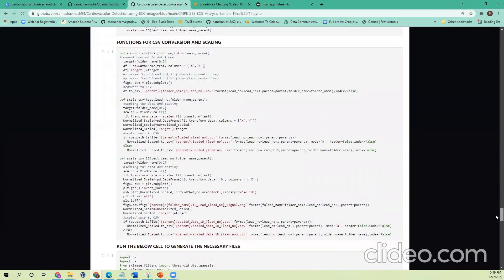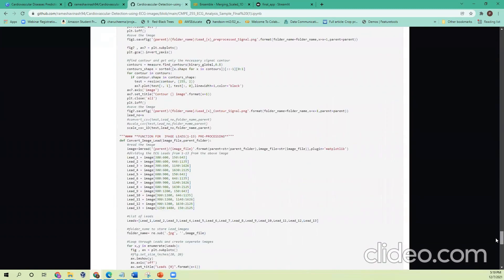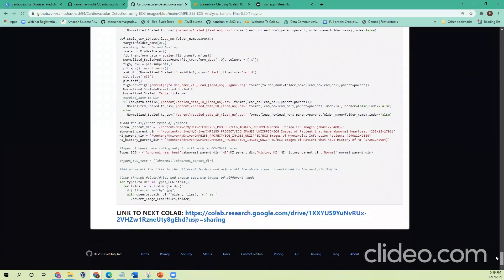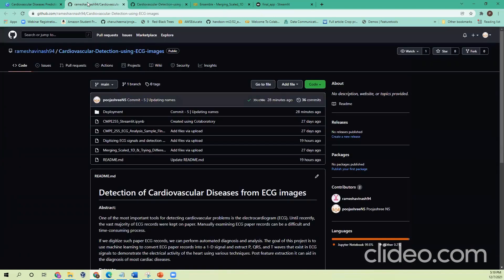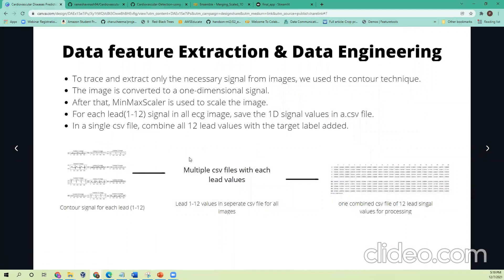Here we have functions for looping through all the files in a Google Drive, extracting all the signals, lead signals, and CSV values. For the feature extraction and data engineering part, once we get the contour image and extract the CSV file, we combine all the lead signal values into a single CSV file. Prior to passing to our ML model, we have a single CSV file containing 12-lead values across all 12 leads as columns, with around 1,000 images in the training dataset.